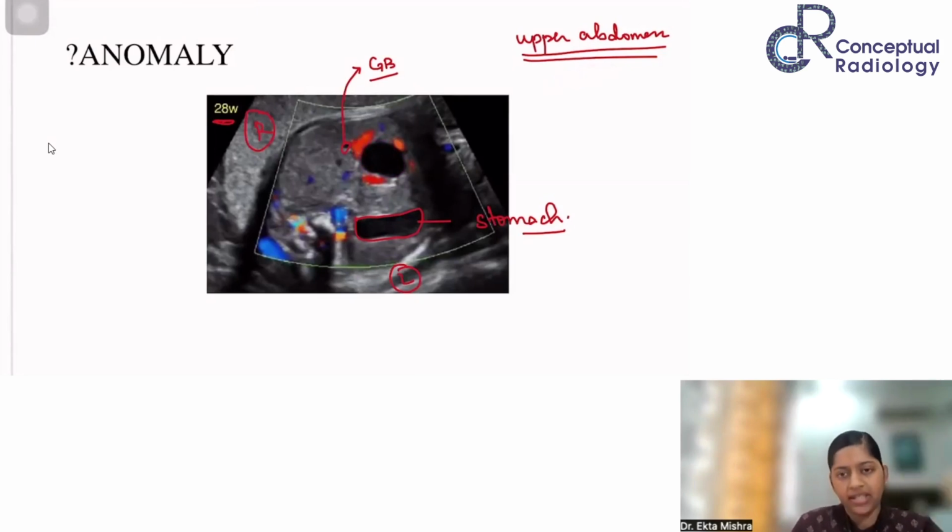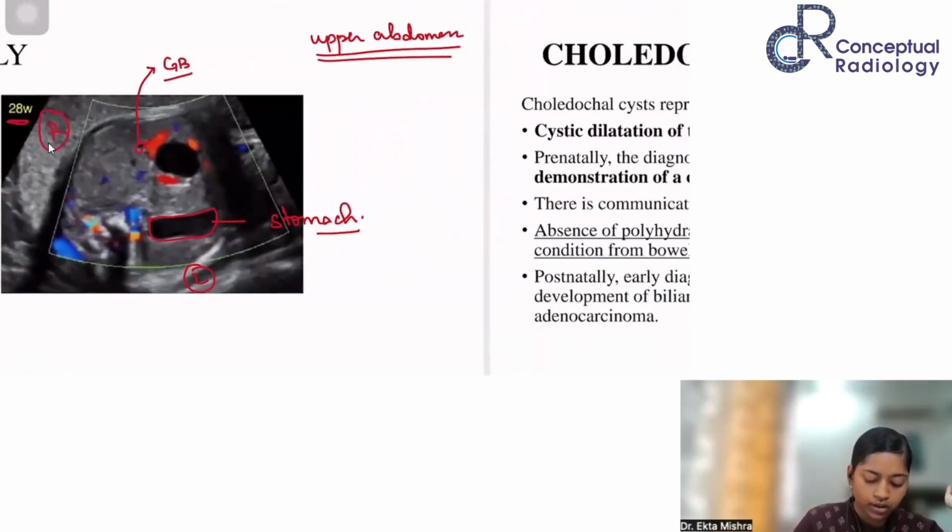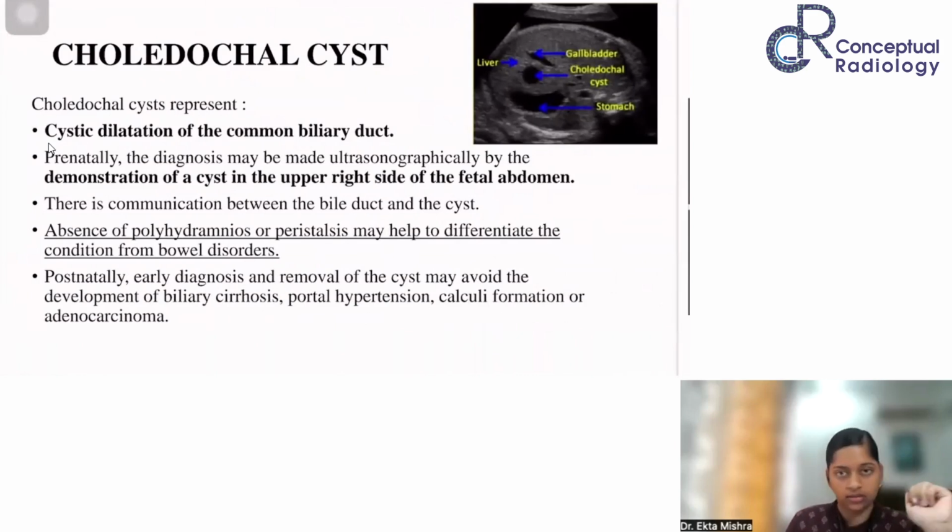It might be mesenteric, or it can be an omental cyst, a choledochal cyst, or it can also be an intrahepatic cyst. GI duplication is a little difficult in this; it won't fit into the differential because of the location. So just mentioning the cyst would also work, and referral can be done. But for our interest, we'll delve deeper into the topic.